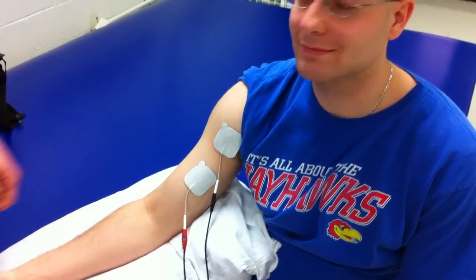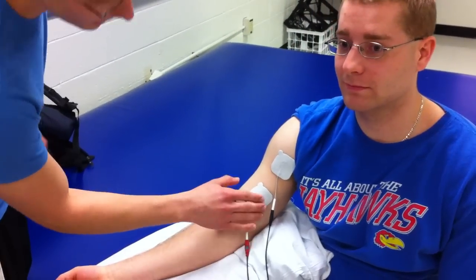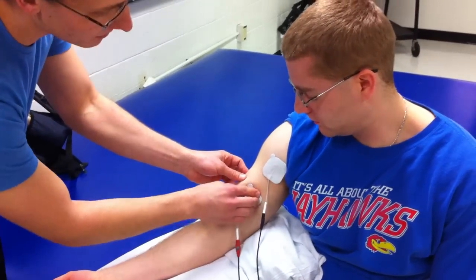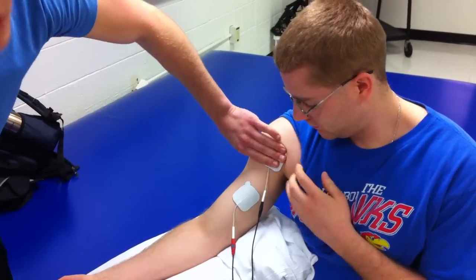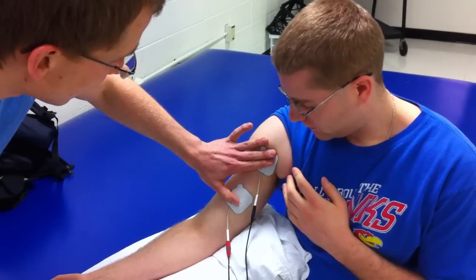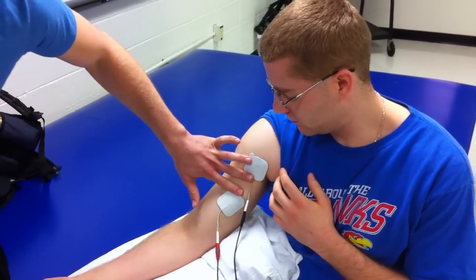We're doing Russian E-STEM, and our target muscle is the biceps brachii. The motor point for that is just right about in the middle of the muscle belly, and then we're going to put the other one near the origin of the biceps brachii. We want at least a pad length difference.